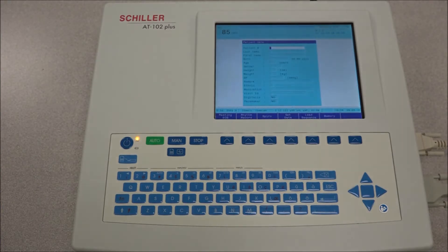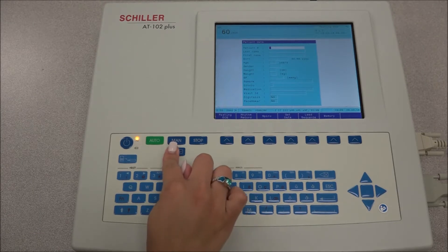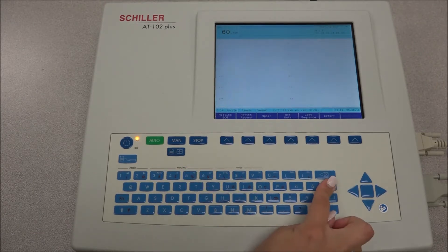To perform a recording of a resting ECG, first input the patient data by pressing the patient key. Once all the information is entered, an automatic recording can be taken by pressing the AUTO key.